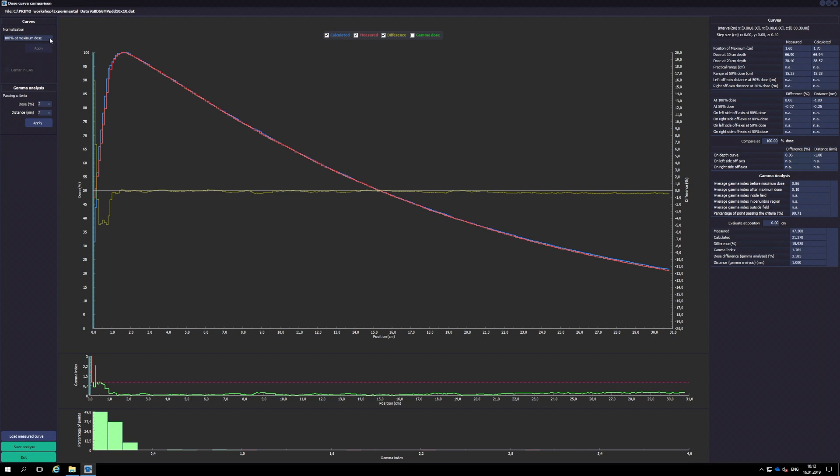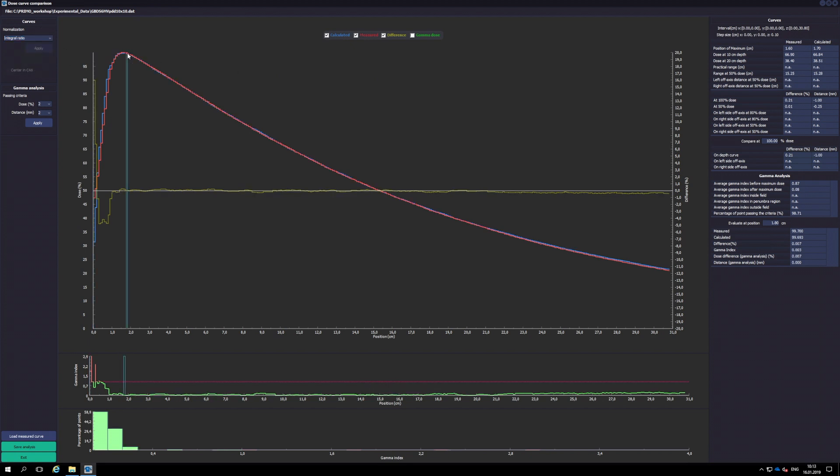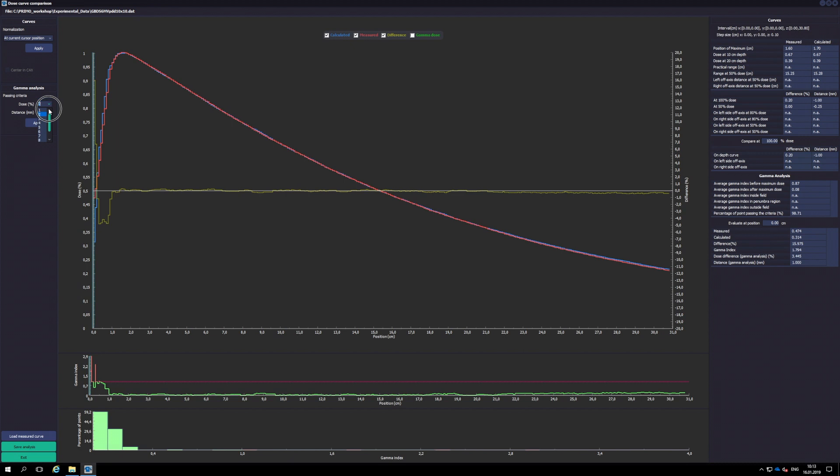The normalization method of both curves can be chosen from the drop-down menu on the left. The passing criteria for the gamma analysis can also be changed. Numerical results appear on the right.